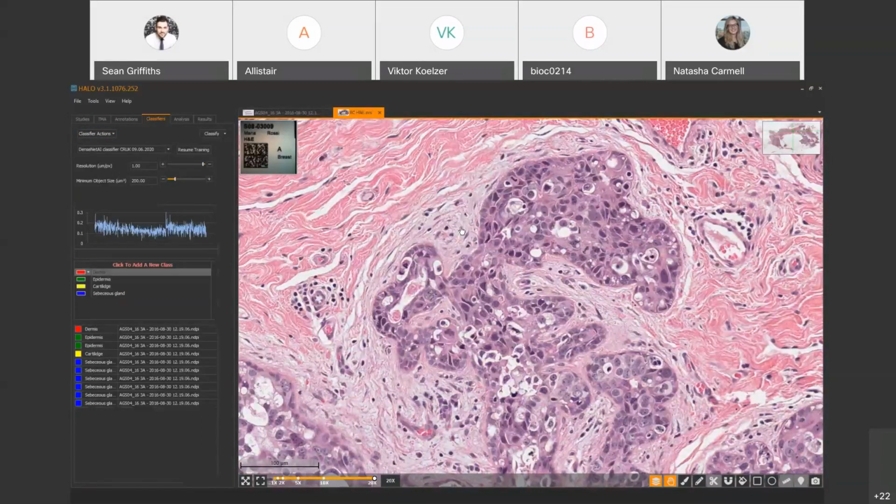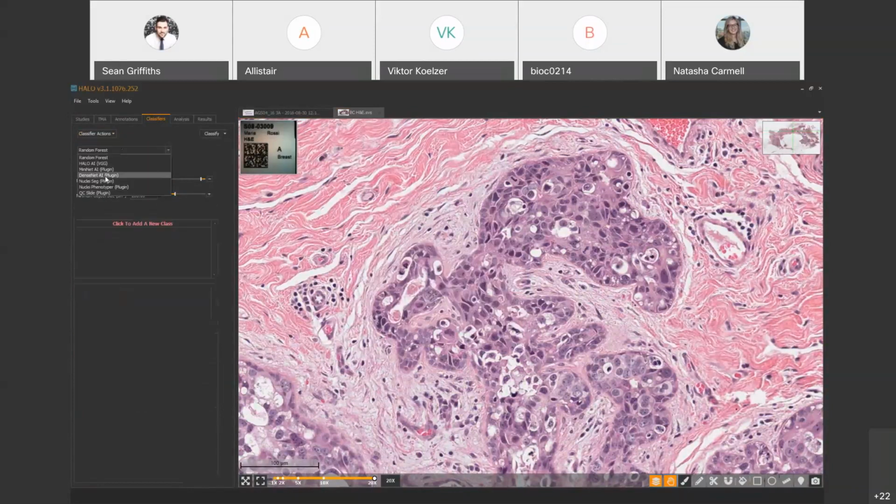So as long as you're covered by the service contract, then you get the training from myself, Natasha, and Ghislaine, all of the technical support from Billy and Mark, and then updates to the Halo software itself, but also to the individual modules. AI is termed a module, so these things here. If I go to new, it's not saved. These additions here, they're all going to be included as well. So you'll just see that this list increases.